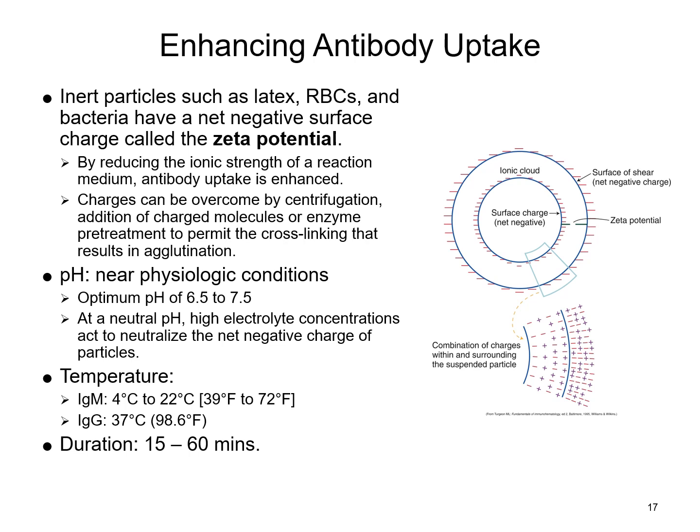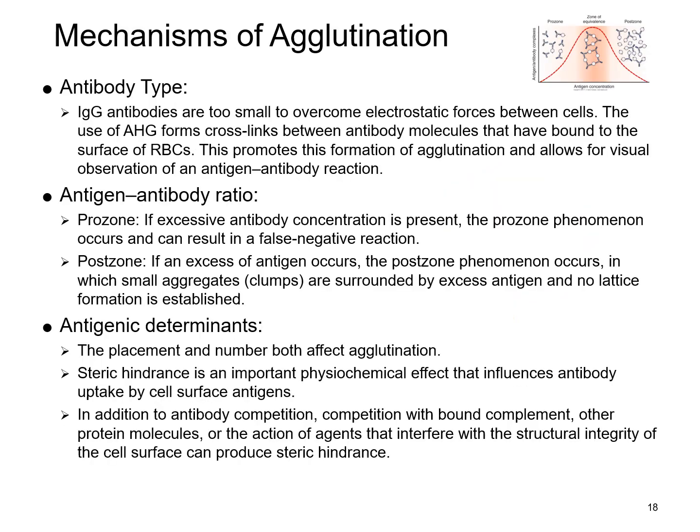The duration of time that you allow this reaction to take place can also be a factor. Most of the tests you're going to do are anywhere from 15 minutes to an hour. There are some tests now, with the development of better reagents, that I have seen with incubation times as quick as 5 minutes. All right, so let's talk some more about some of those other mechanisms.